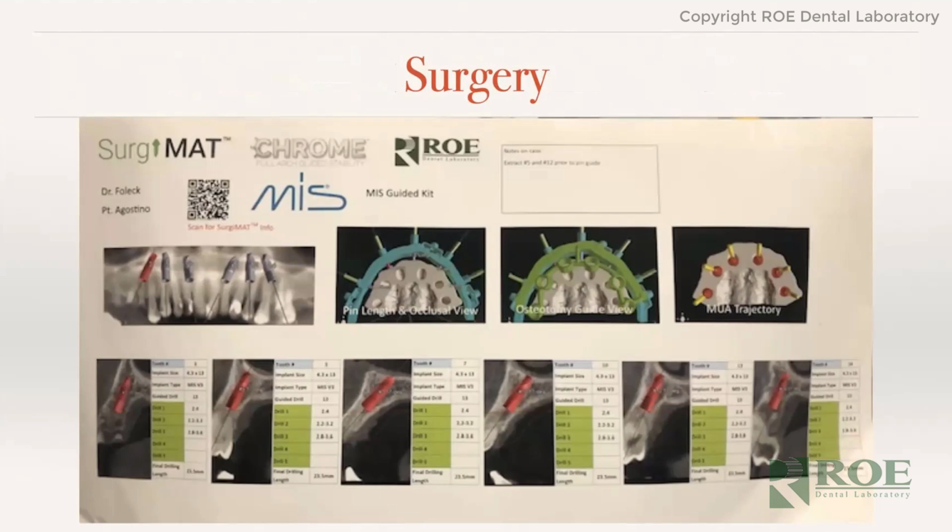So now, instead of our GSI report that we would normally get, we have this wonderful screen, a poster board that comes with our cases now. And this is a case we just did about 3 weeks ago, before the COVID. And this is wonderful. We put this up behind us where I'm working. I used to have a piece of paper with all the implants and the sizes written in big numbers and letters so that I could see the position of everything because the reports were so small.